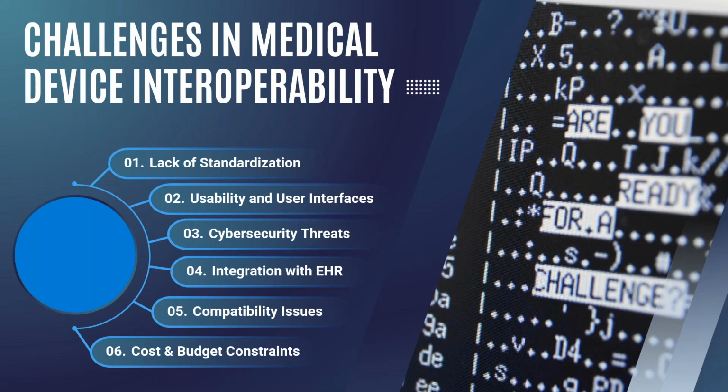Compatibility issues: we have your legacy systems and your old systems. So you can have a single manufacturer model, but you have Windows 7 working with Windows 10 and Windows 11, and they're all technically running the same software, but because you're based on different phases of hardware upgrade, they always have to work with one another.